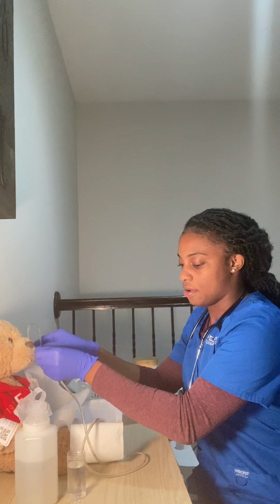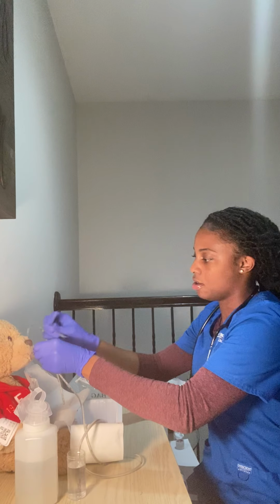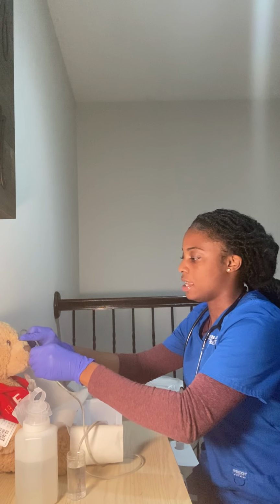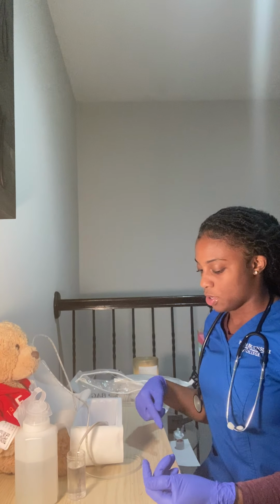And once I do that, which I am, I'm just going to tape it, one piece here, one piece over here, just to hold it in place and check my placement. So now that I've got it inserted, I'm going to check my placement.